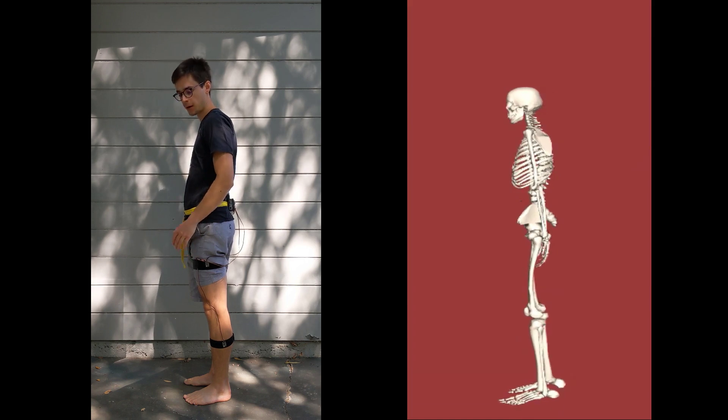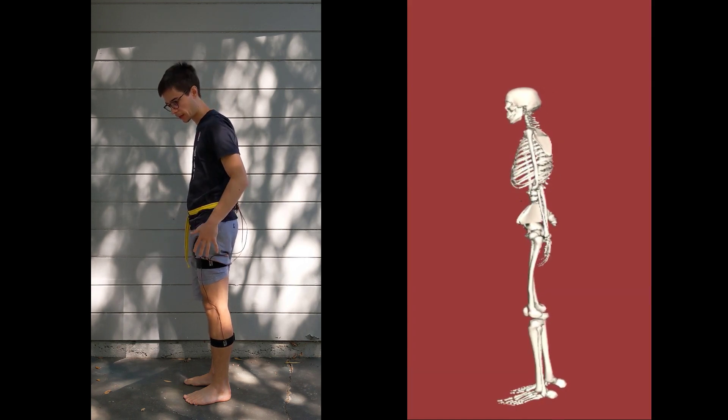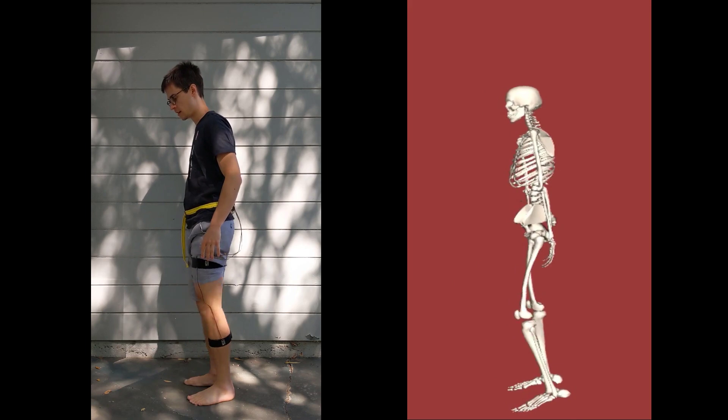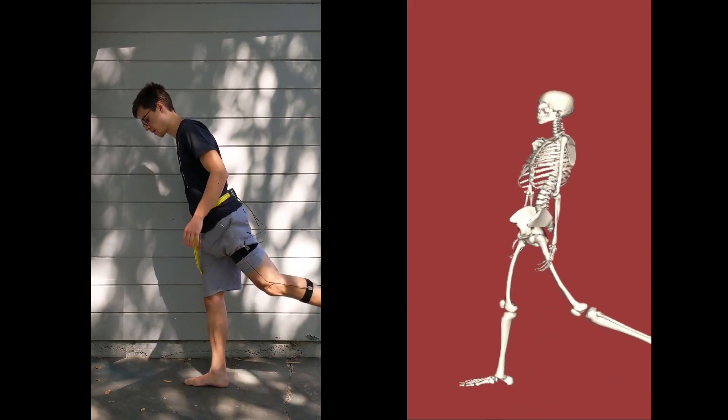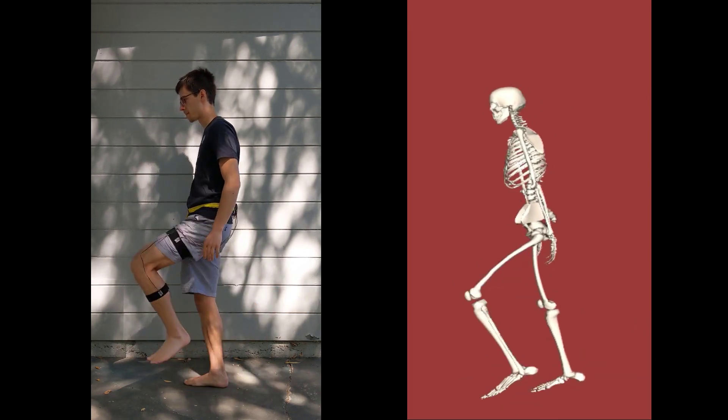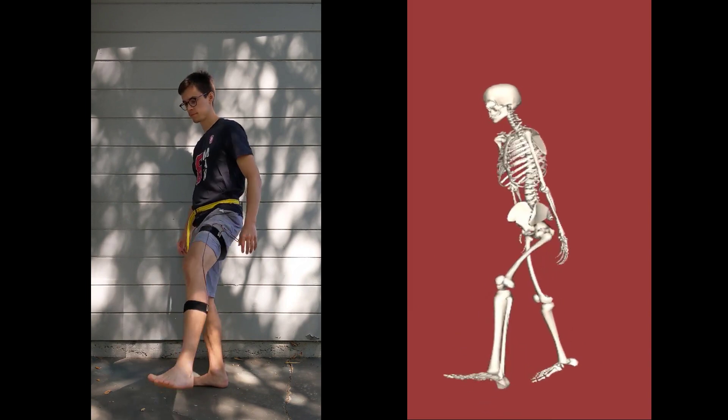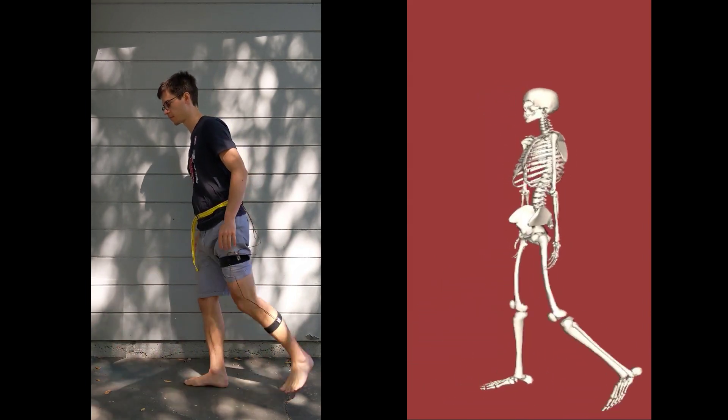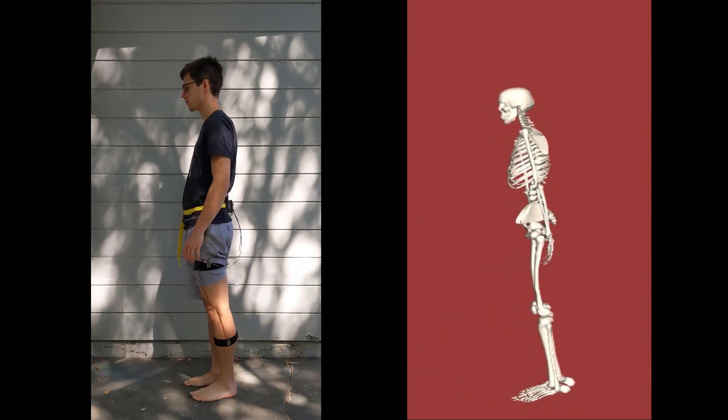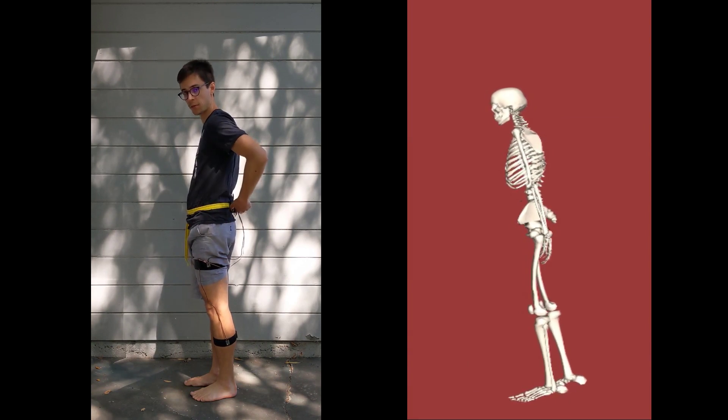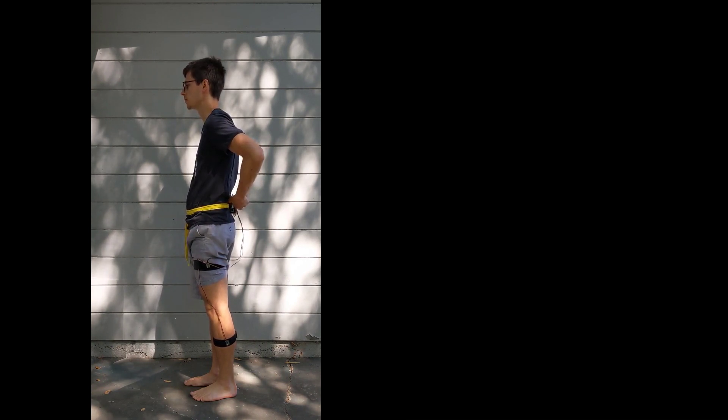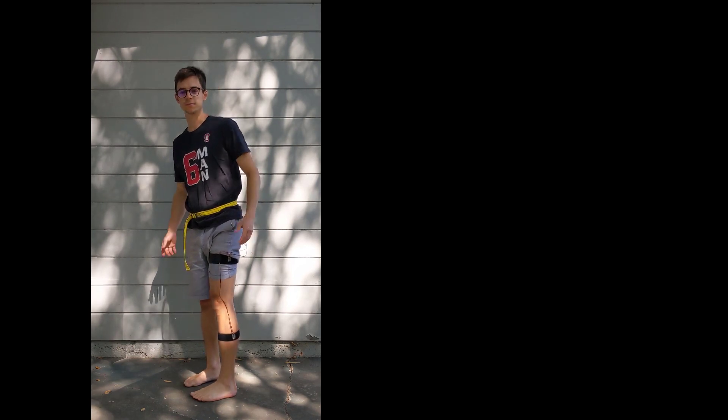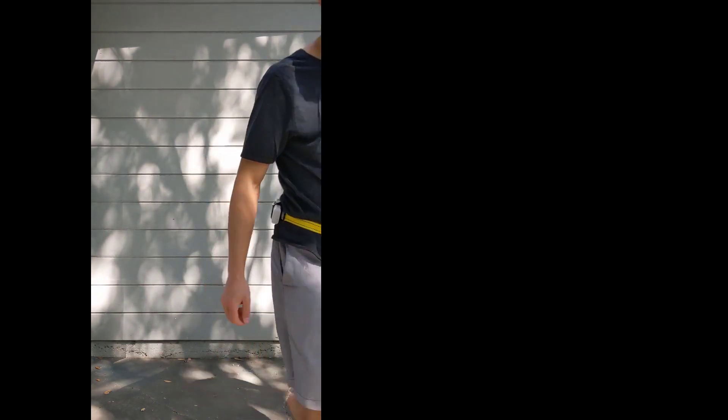And now I'll put a side-by-side of the simulated leg in my leg so you can see how it tracks the motion. And then to stop the recording, I'll press the button again. And that's how you use the device.